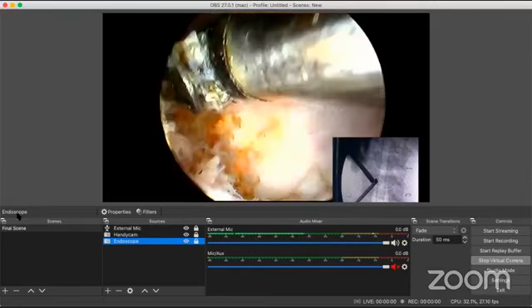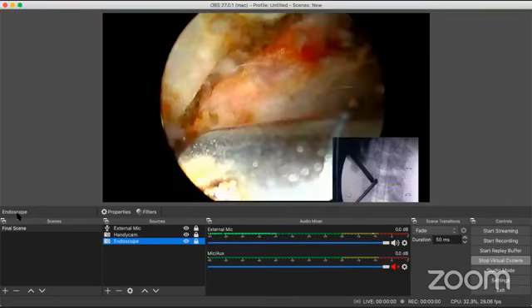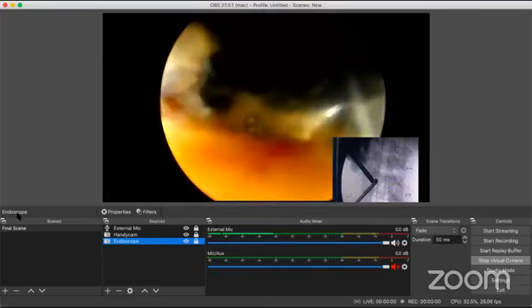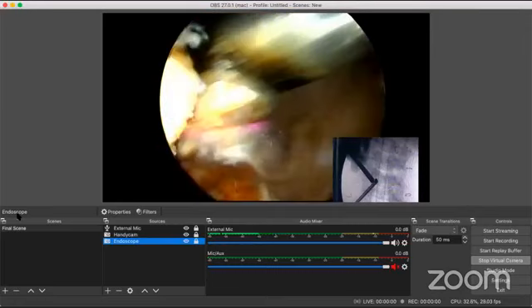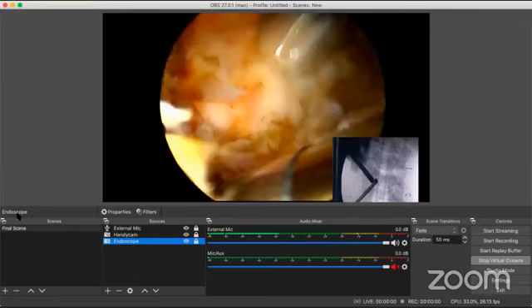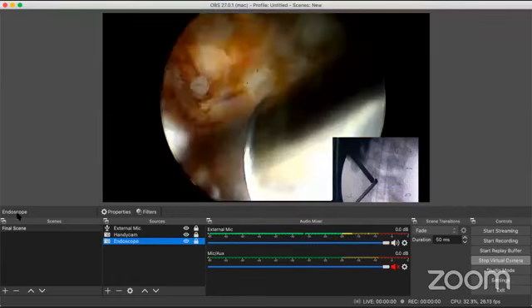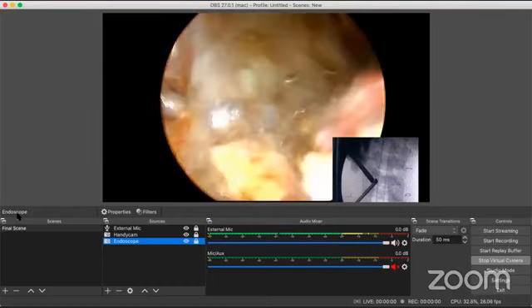Fire, please. And now I'm coming a little laterally. So that is where I intend to work. If I don't come laterally, then I don't know what I'm doing here. So now I'm going to come upon my V point, what we commonly call a V point in cervical spine surgery. Now the funny part here is, see, upper lamina, lower lamina.